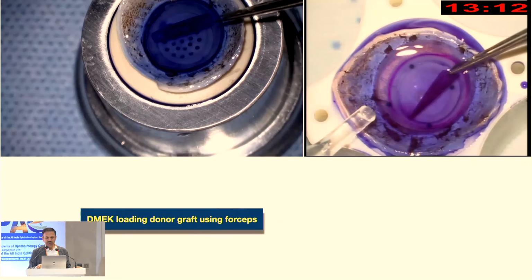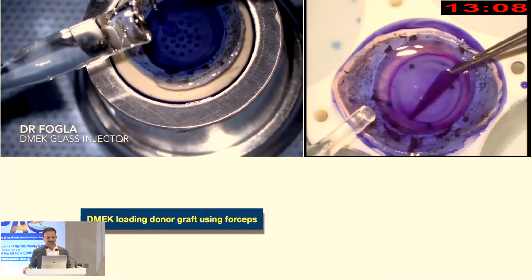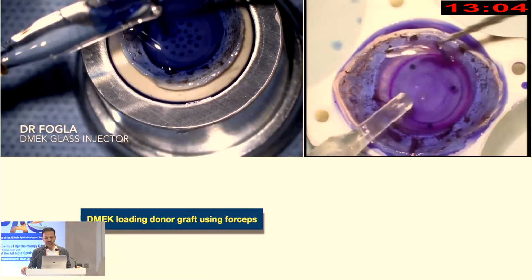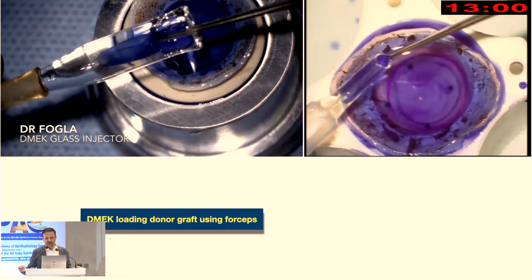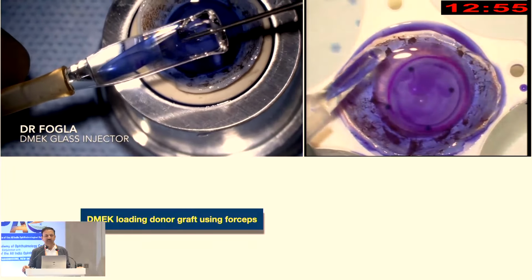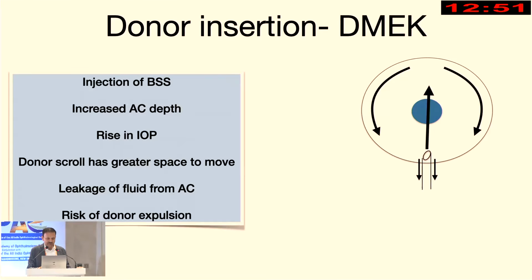Or you can catch the scroll at one end, lift it up, and gently pass it into the injector system either from behind or from the tip. By capillary action, it just goes in, so there are different techniques of doing it. You can practice in the wet lab, and whichever works for you, you can use in your clinical practice.